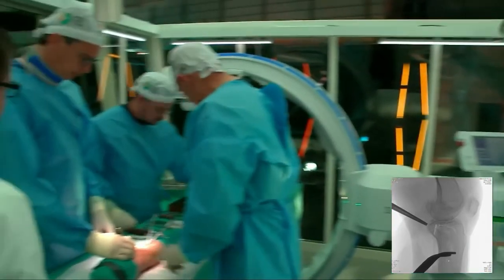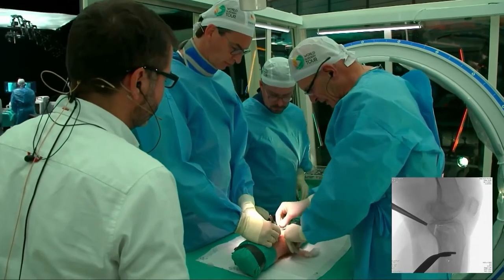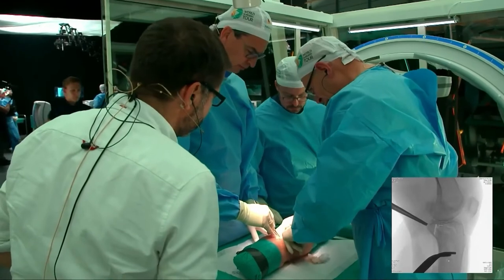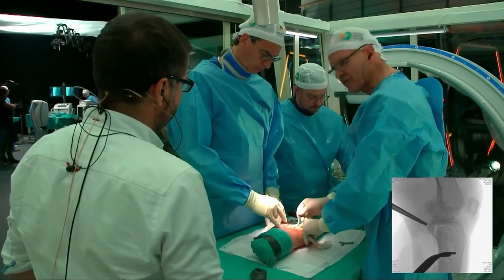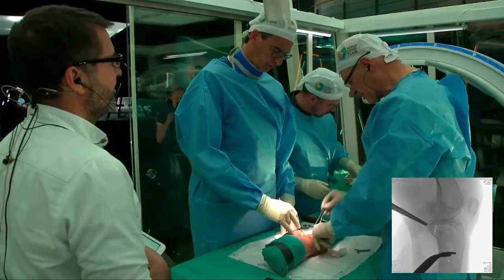Beautiful. So we need the posteromedial plate, and we're going to place it not too medially. The good thing about this posteromedial approach is that you can also go far to the lateral side, so if you have some fragments there you can even address them.